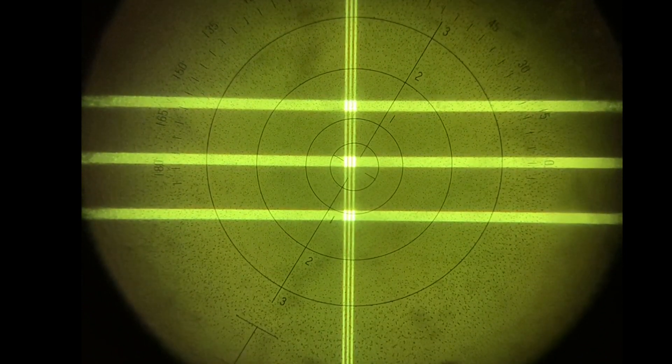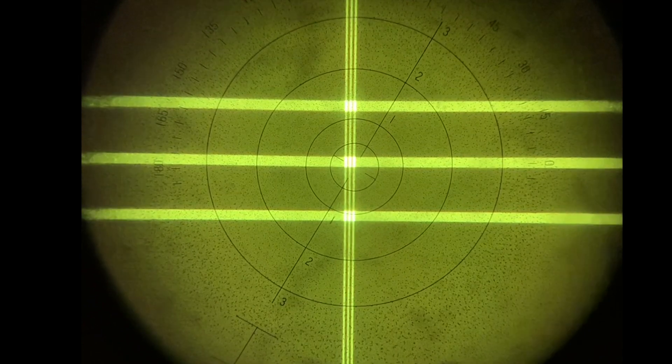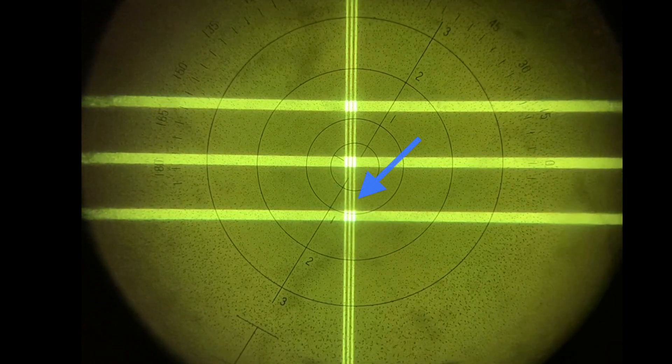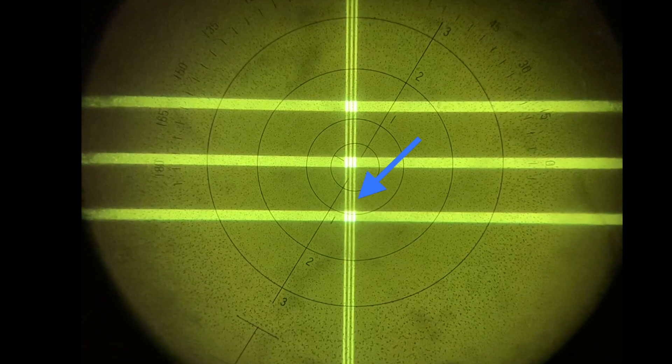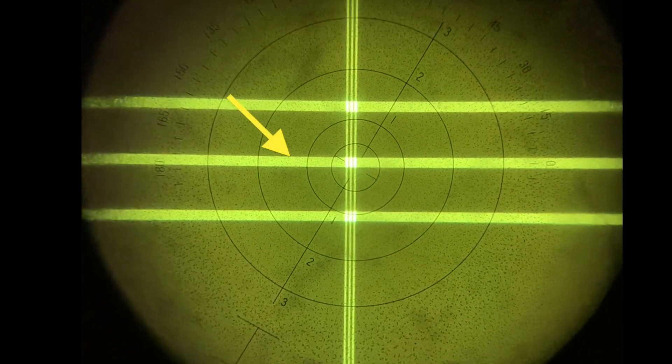In manual lensometry, you'll notice two sets of parallel lines. The blue arrow indicates our sphere lines. The yellow arrow indicates our cylinder lines.